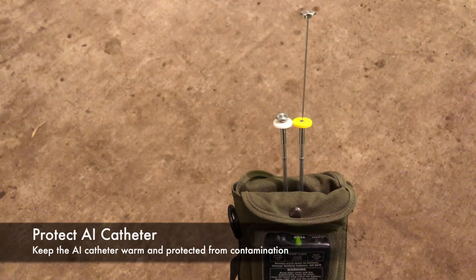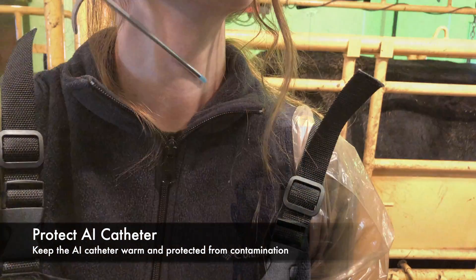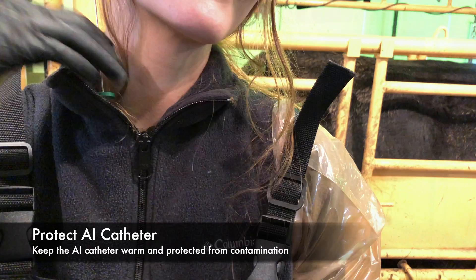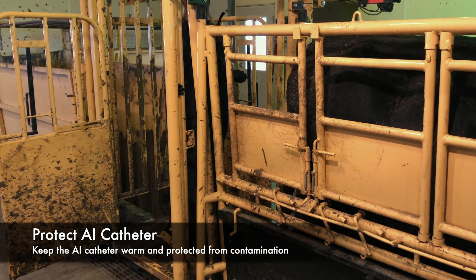Apply lube. Keep the loaded catheter warm and protected, either using an AI gun warmer or tucking it into your shirt until you are ready to AI. It is important to keep the tip of the catheter as clean as possible in order to avoid introducing bacteria into the uterus.